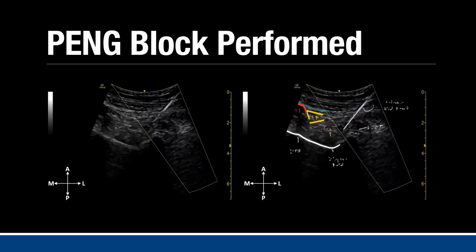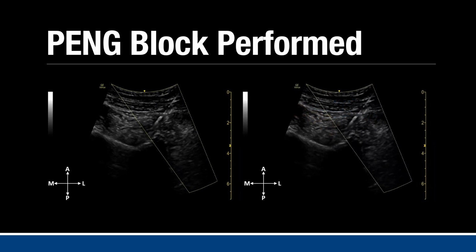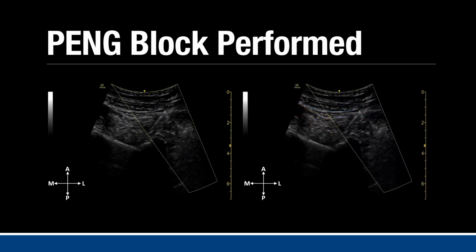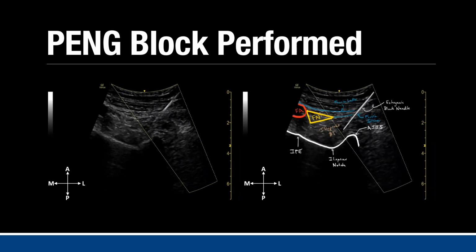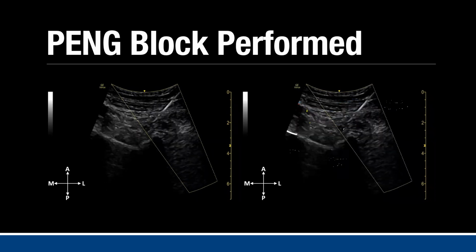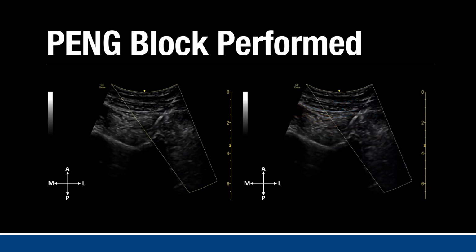Okay, so you're basically just going just medial to the AIIS, hitting the bony backstop, which is the iliopsoas notch, and injecting along that plane, which should push the iliopsoas muscle up along with the psoas tendon, and that'll confirm that we've hit these articular fibers that innervate the hip capsule, the nociceptive fibers that are causing all the pain.